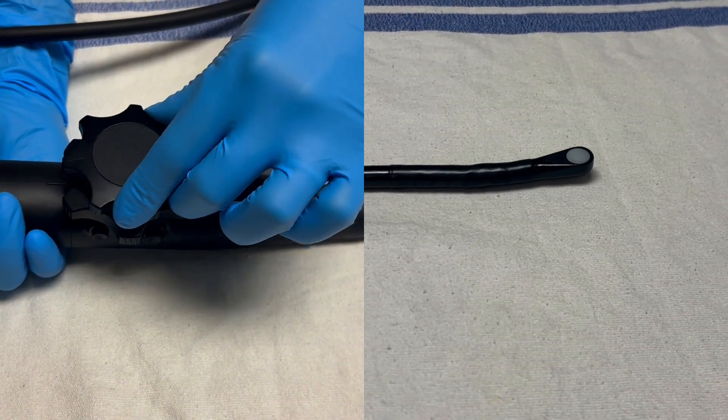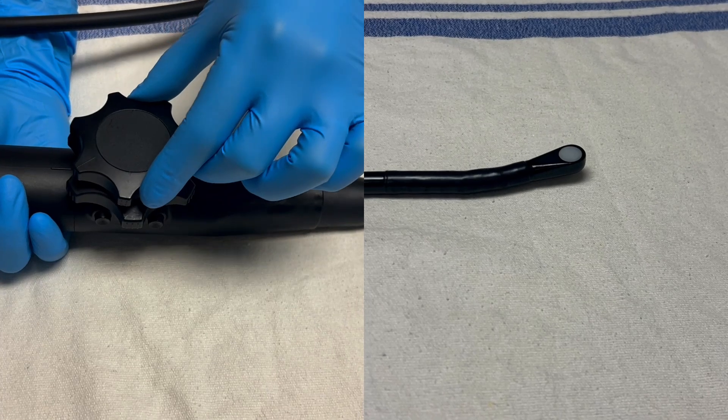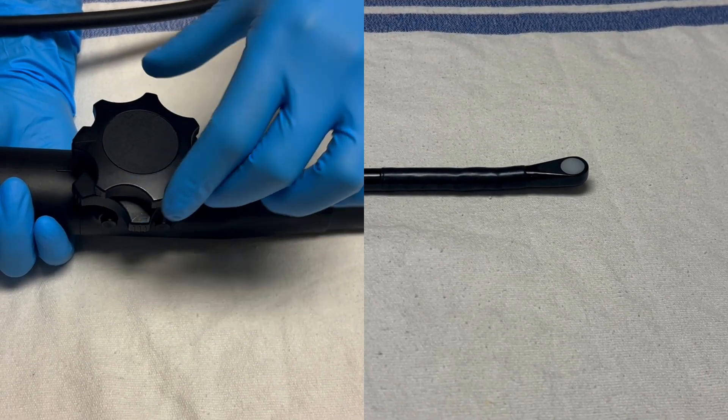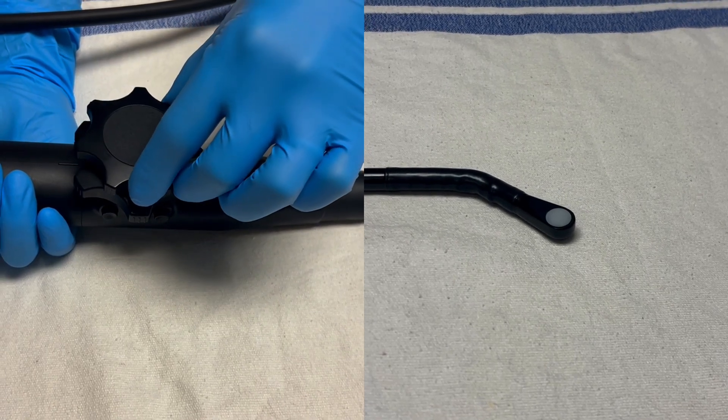The head of the probe can also be manipulated to move left and right. To do this, place your hand on the outer and typically smaller wheel. To move left, rotate the wheel counter-clockwise. To move right, rotate it clockwise.